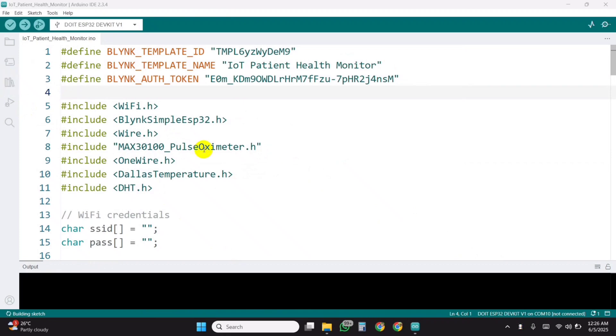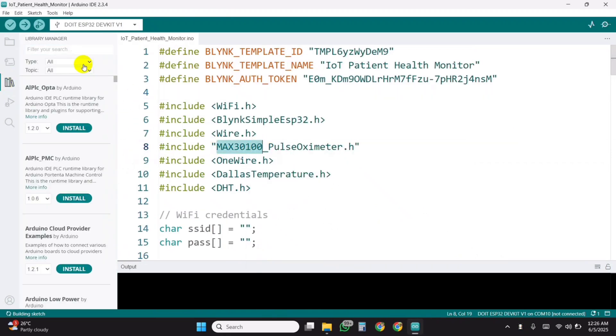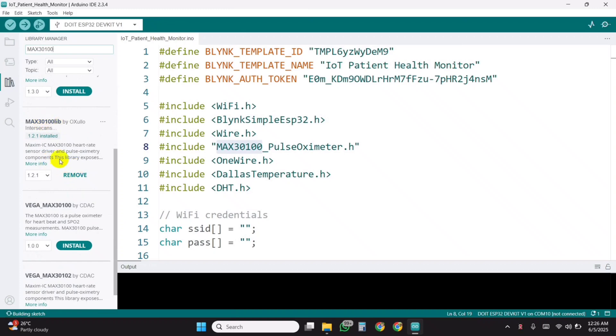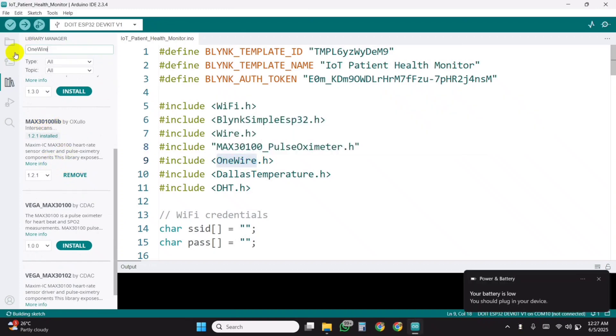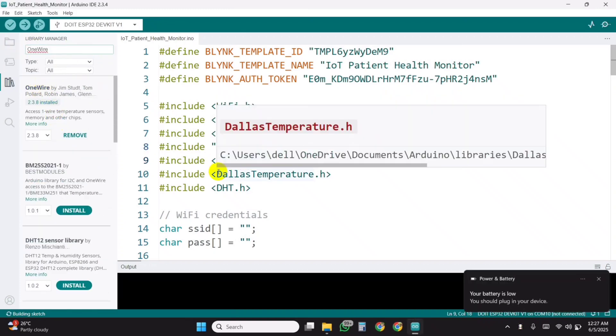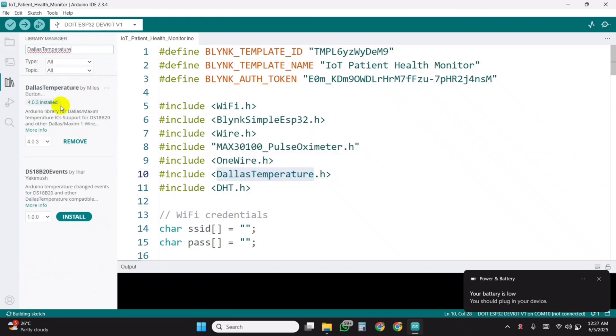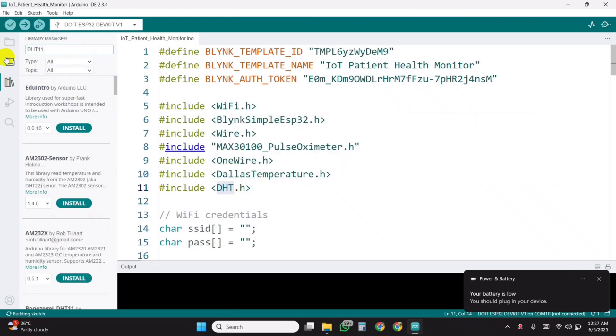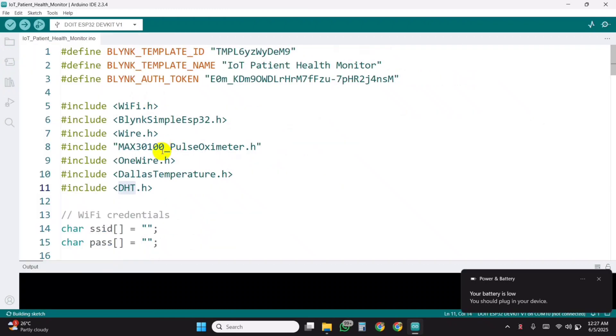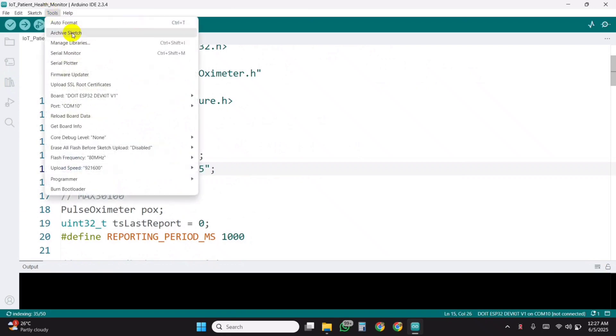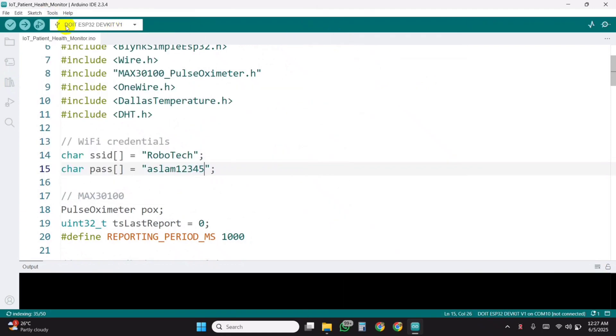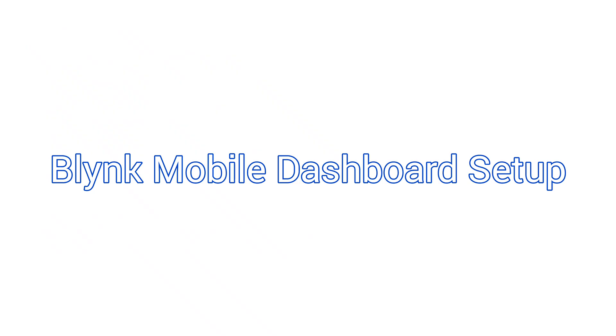You need to install all these libraries for this project. You will find them in the Arduino IDE Library Manager if missing. Also, update the Wi-Fi credentials in the designated section of the code. After everything is set, select the ESP32 dev module as the board, choose the correct COM port, and upload the code.